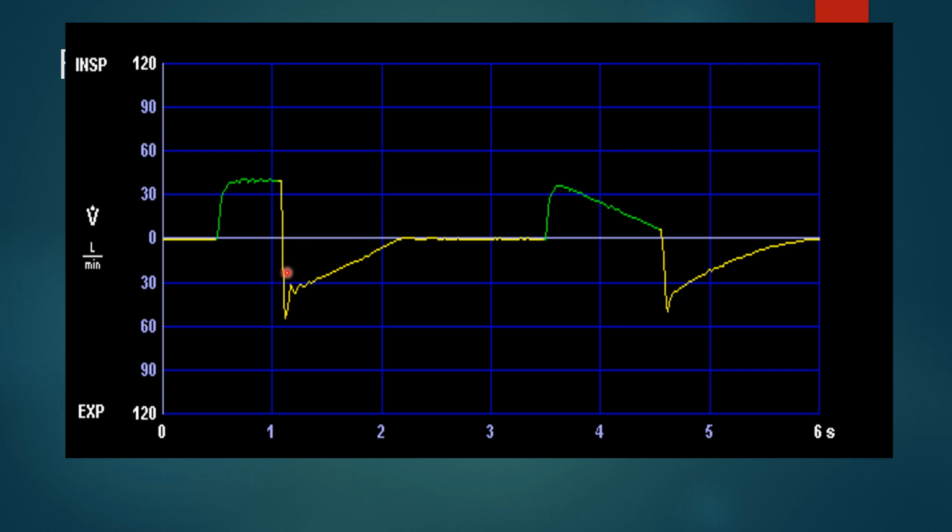So here, this is the ventilator exhaling down to here, and that's actually the tubing exhaling. And here is the patient's exhalation right here. He exhales, the flow gets slower and slower and slower, and then when he gets up to the zero flow, then the air is not coming out anymore.